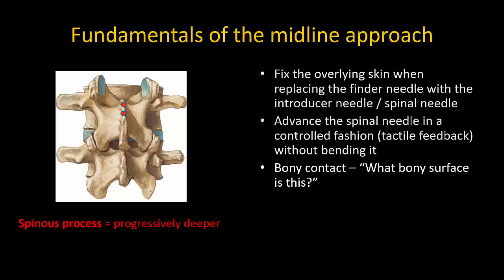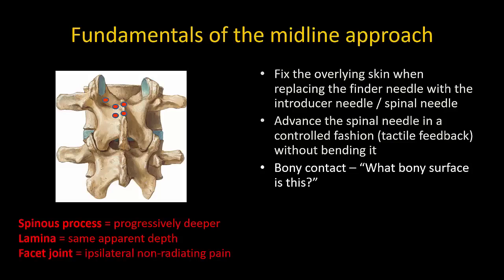If we are on the spinous process, cranial angulation will take us progressively deeper. If we are off the midline and walking up the lamina, it will feel like we are striking bone at the same depth each time. If we are very far off the midline, we may strike the facet joint, which will elicit pain on that ipsilateral side.